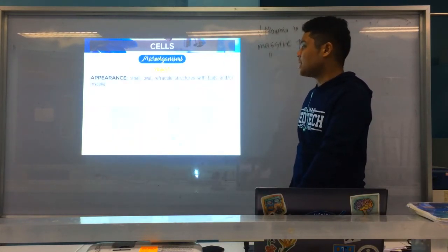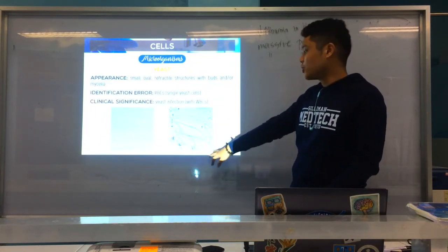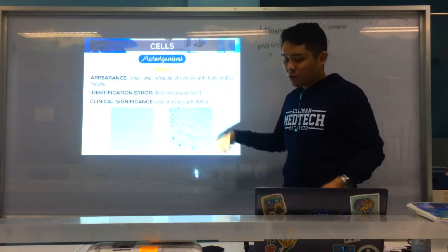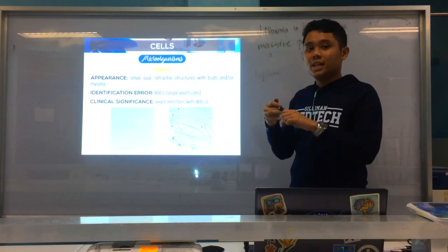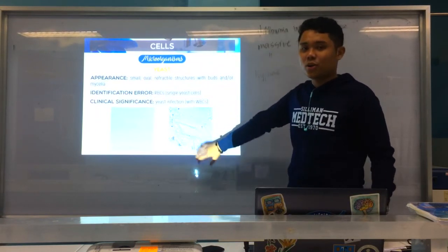Alright. Next, again, for yeast. Usually for Candida albicans. So these are example your yeast. And this is example your budding yeasts. So, ni mga, what we call our hyphae, di ba? Hyphae. So, these are parang mga structures sa yeast, alright, this is really intense na yeast infection.